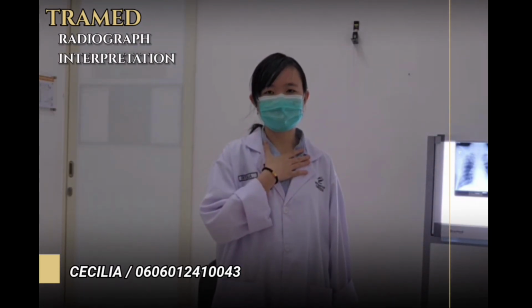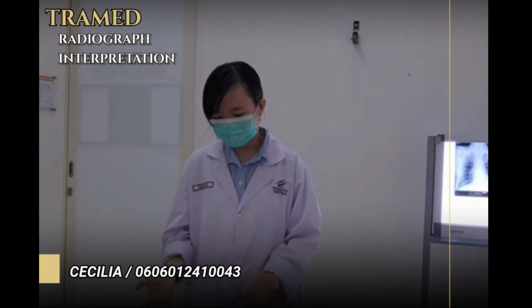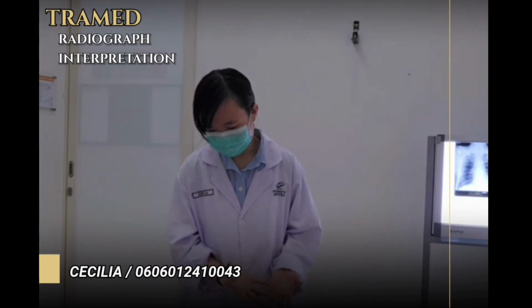With NM43 from the IC class. And for today, I will be the one who is examining the patient to check about radiograph interpretation skills.